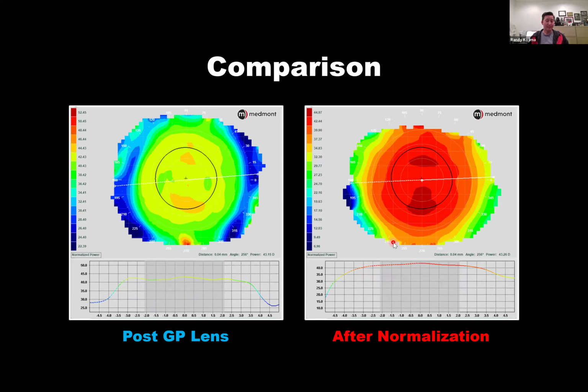Randy nos está contando un ejemplo donde él tiene unas hermanas, básicamente 20 años usando ortoca, le iba muy bien, pero últimamente están notando como que un poquito de dificultad manejando de noche, unas aberraciones raras, y hacen la queja y Randy pues las está verificando.